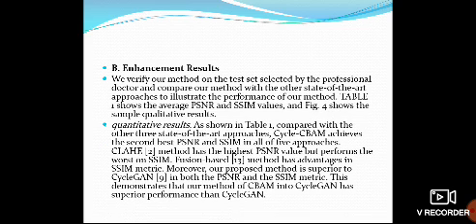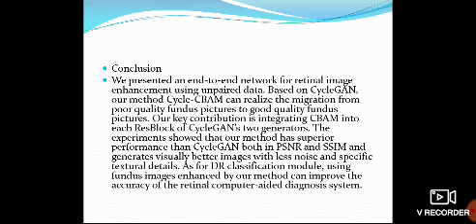The results: we verify our method on the test set selected by professional doctors and compare our method with the other state of the art approaches. We presented an end-to-end network for retinal images. Our method Cycle-CBAM can realize a migration from poor quality fundus pictures to good quality fundus pictures.